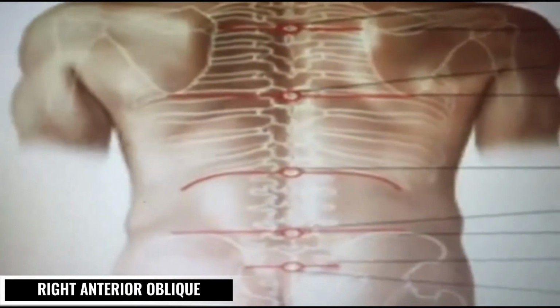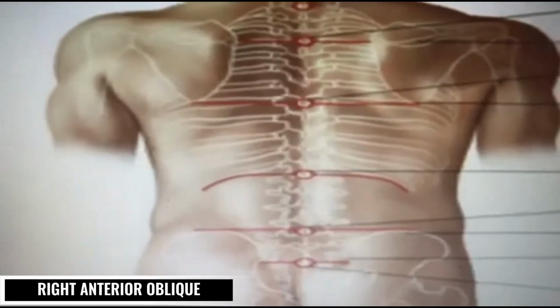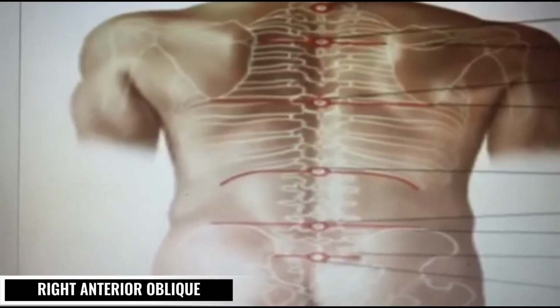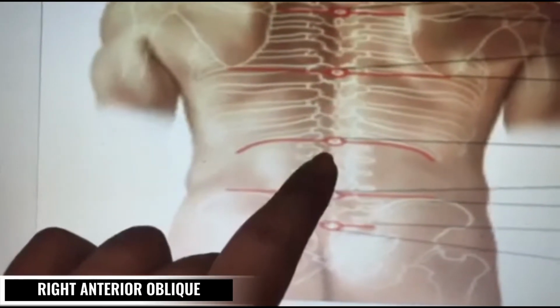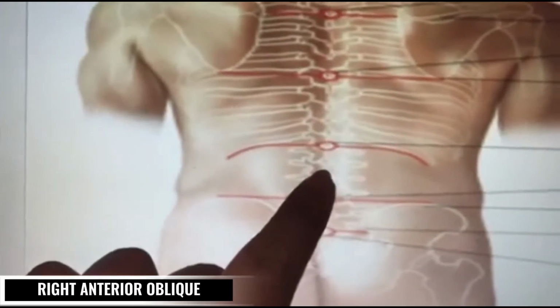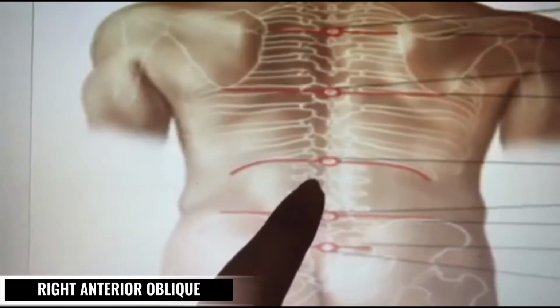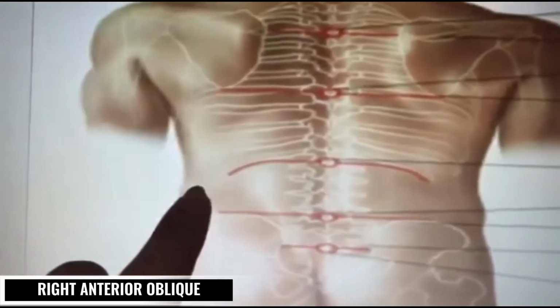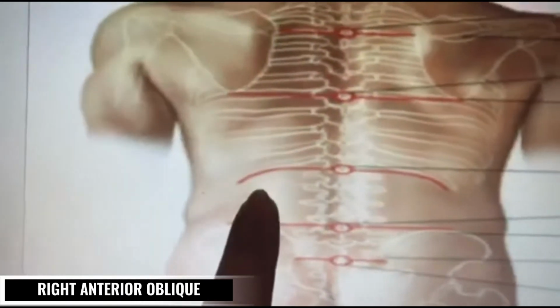The next body type is the asthenic type. For the asthenic type, the organs are more adjacent, so the central ray is about 2 inches below the L1. We determine that this is the L1, and 2 inches below it is the place for the central ray. Again, this is the midline between the spine and the lateral border of the abdomen, so we place the central ray here.